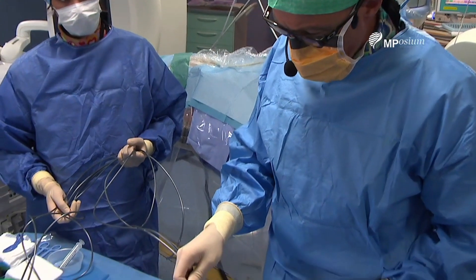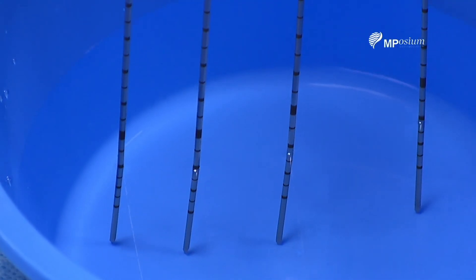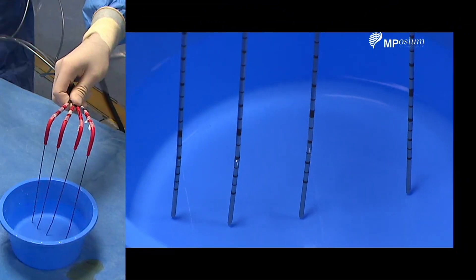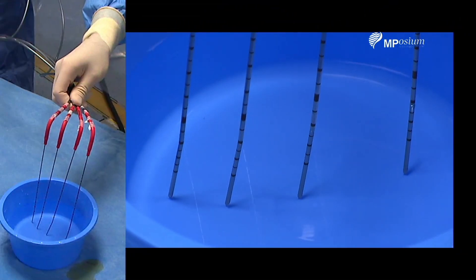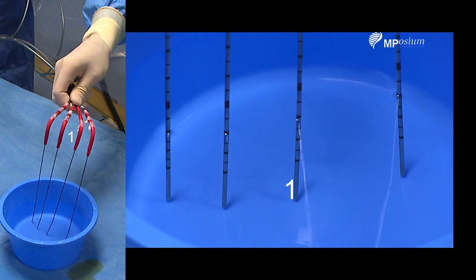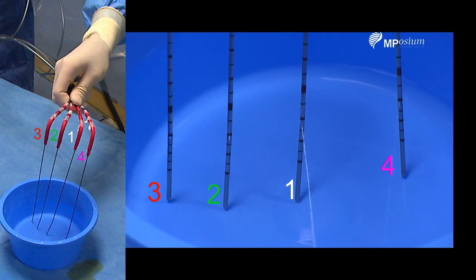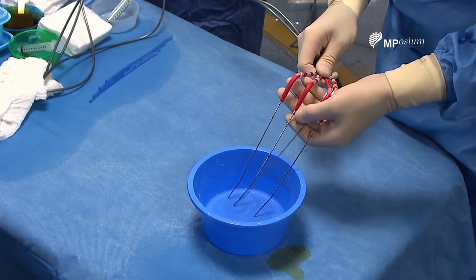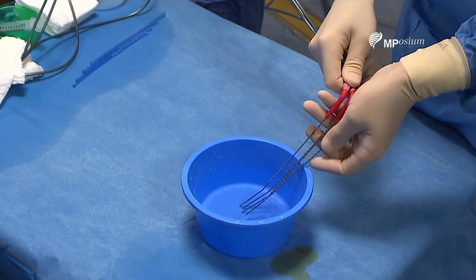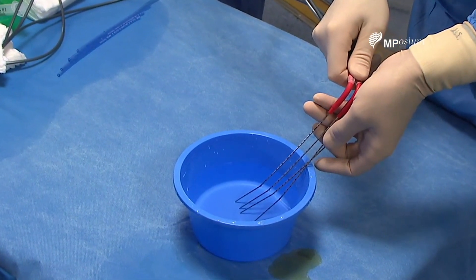During this case we'll use four cryo probes — ice-rod cryo probes. They have been numbered according to where they are plugged and which channel. So we have needle on channel number one, channel number two, channel number three, and channel number four. We are now doing the cryo test and we can confirm there is no gas leakage through any of the probes.